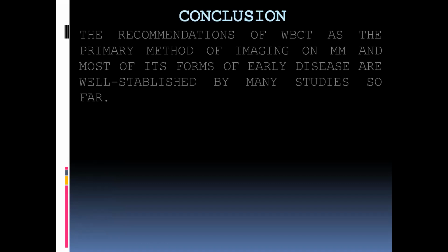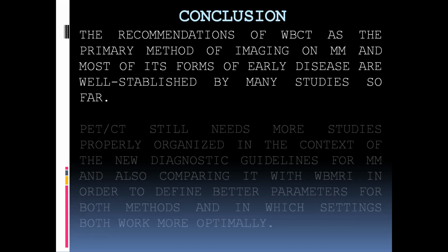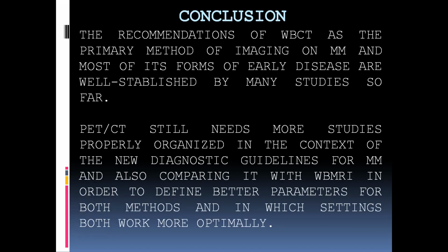Então, as conclusões. O IMWG, que é o grupo de estudo, definiu que a CT de corpo inteiro é o melhor método, indiscutivelmente. O peso dos artigos repetidos sobre isso já provou; artigo atrás de artigo mostrou que a sensibilidade é muito maior do que o método tradicional com raio-x do corpo inteiro, quer dizer, dos principais ossos, do raio-x.